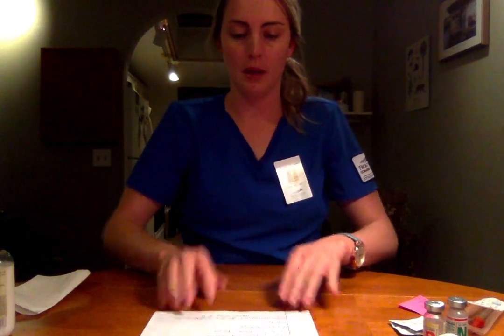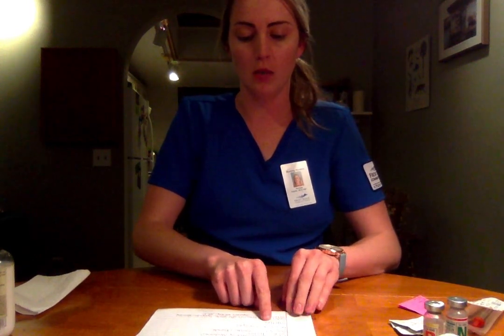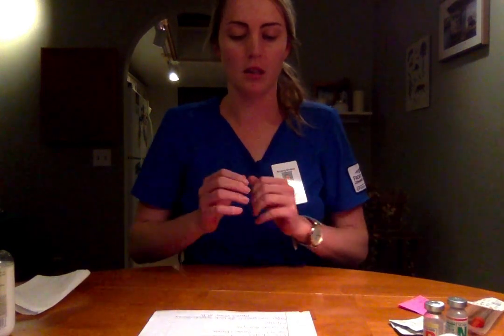Okay, so the MAR states patient name Abby Abdomen, date of birth 11/3/55, age 64, gender female, no known allergies, and the date today, April 19th, 2020, and the order is to administer NPH insulin 26 units subcutaneously stat. So now I'm going to select the correct vial, NPH insulin. So I have regular insulin and NPH, so of course selecting NPH.